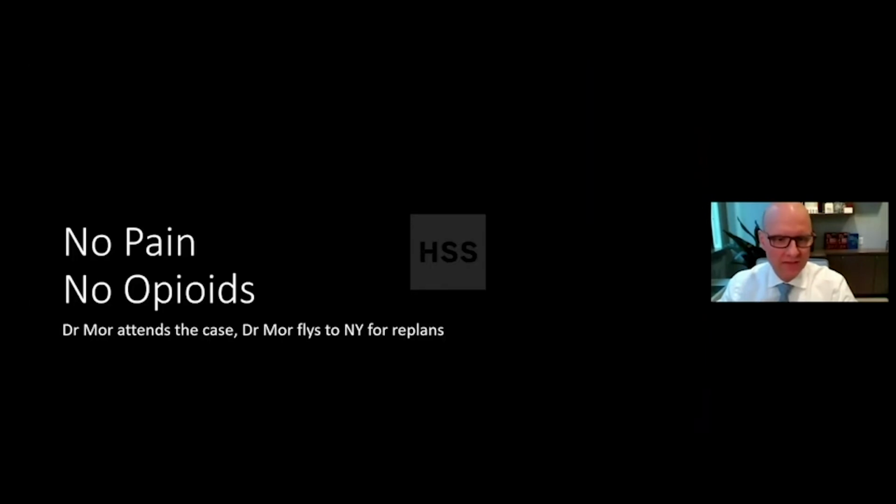Patient consented to giving his photo. What was notable, this guy had no pain and took no opioids after he left the hospital. So pretty impressive. So pulling through a non-union, lots of wires, and this was only 4 adjustments a day. What if we did 10? What if we did 20 adjustments a day? Really broken into small adjustments.